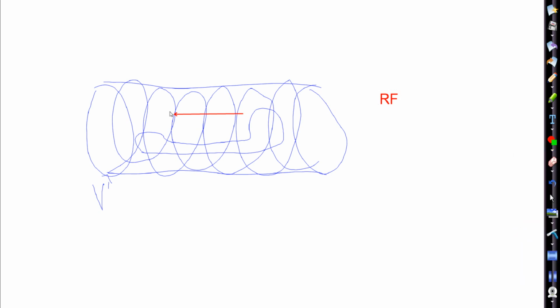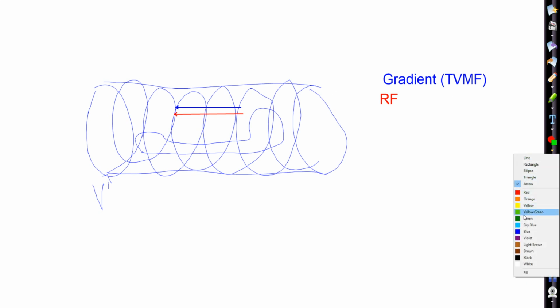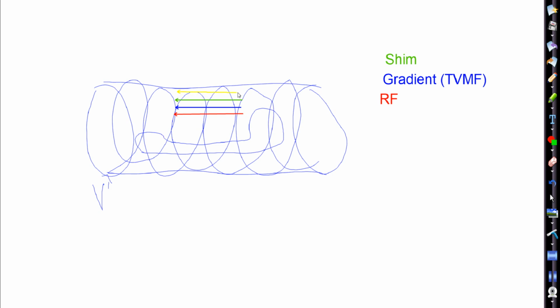Gradient. Gradient can also be called a time-varying magnetic field. All right, what's the next layer? Shim. And then our final layer? Main magnet. Good. Main magnet. Yellow's kind of hard to see, but main magnet.